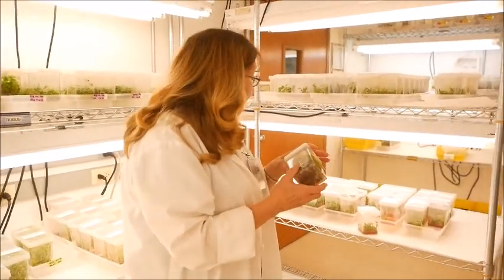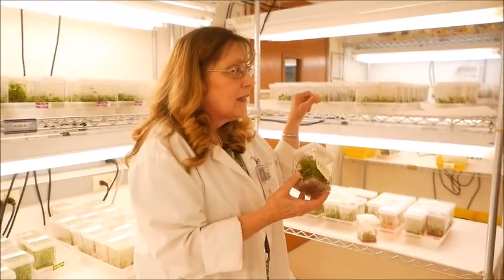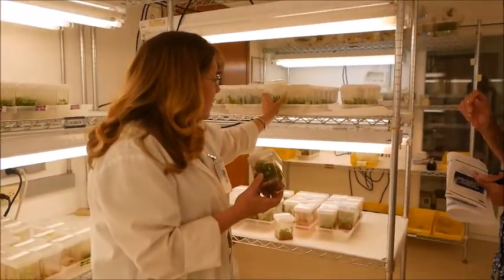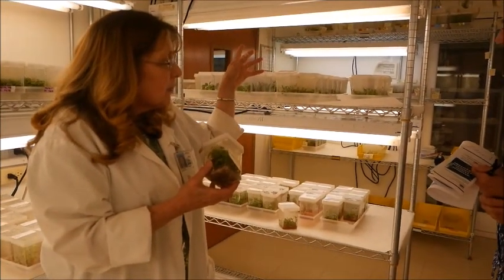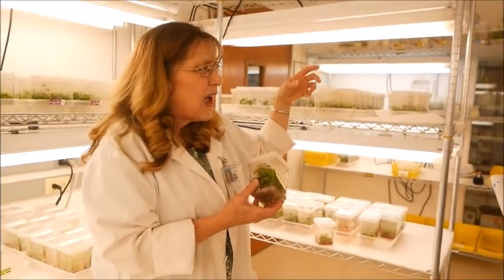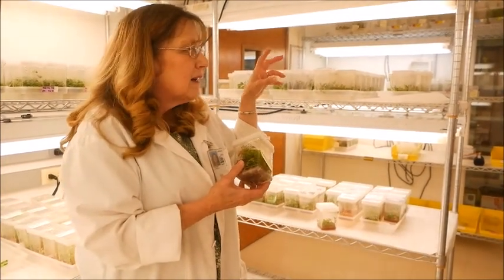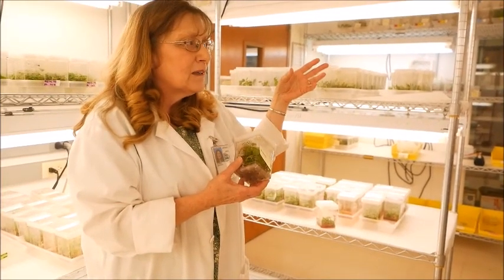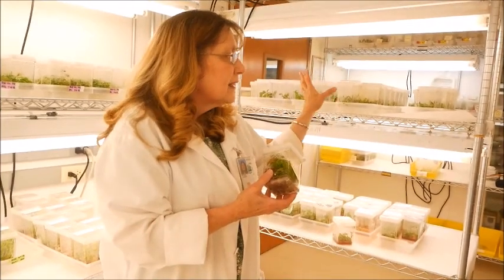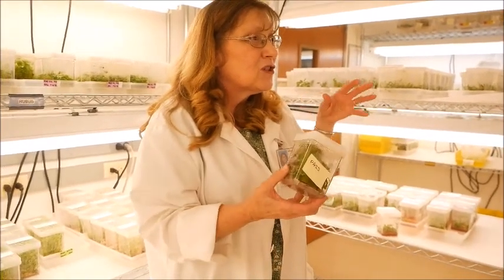Our research over the years here was on formulating the media, and hazelnuts were really hard. The pear was the first thing we worked on — the first media was developed in the 1960s, called Murashige and Skoog, for carrot and tobacco culture. It kind of got the basics of what the plant needed.